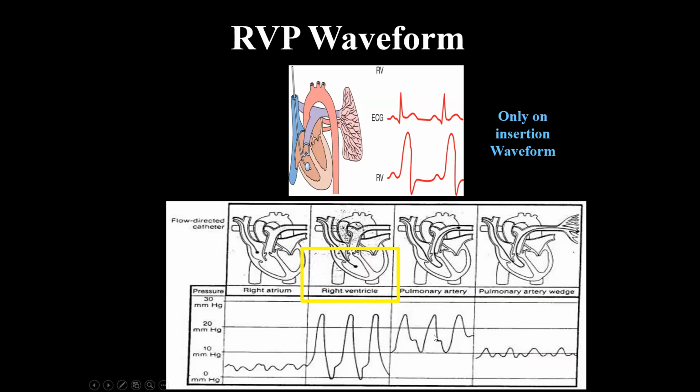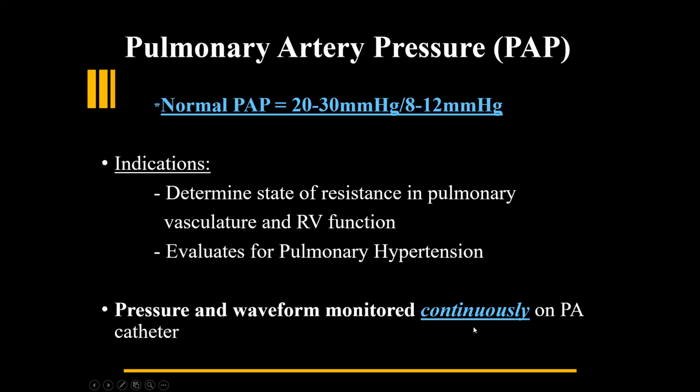You are not to ever advance a Swan-Ganz catheter. Let me say that one more time. Do not ever advance a Swan-Ganz catheter. You will call whoever inserted it to come in and advance it. All right, this is a continuous waveform that you'll see on the monitor.